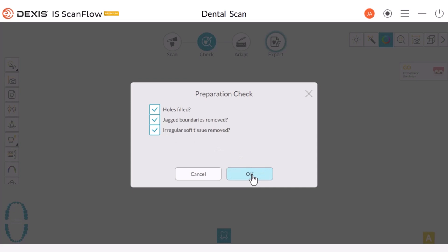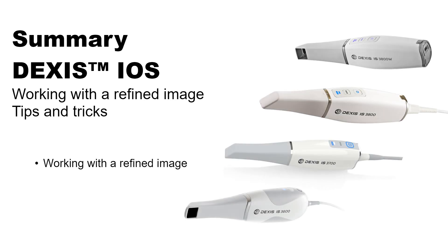Whether you are using the DDX Studio Clinic workflow or the standalone version, the scan will be saved in the appropriate location within the image files or scanning stream, depending on your configuration. This concludes the DEXIS ScanFlow: Working with a Refined Image Tips and Tricks recorded class.